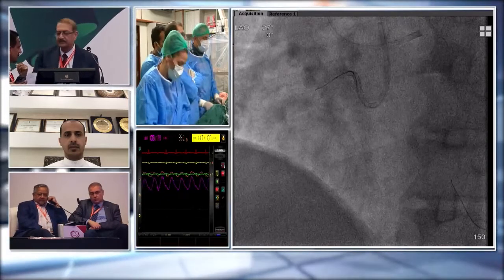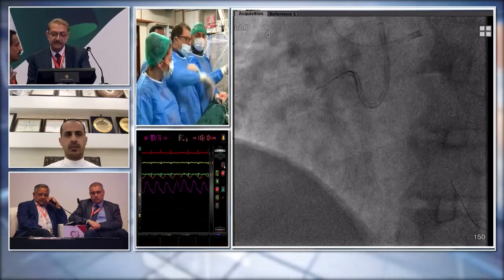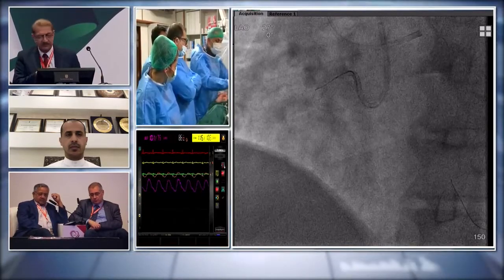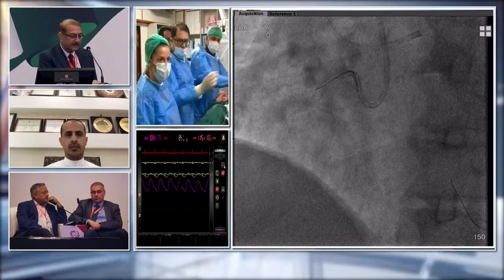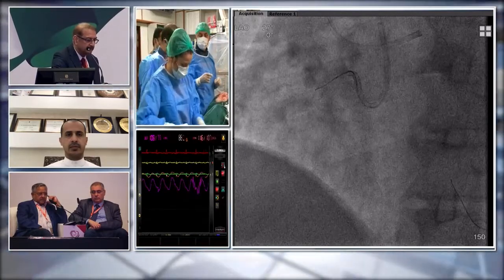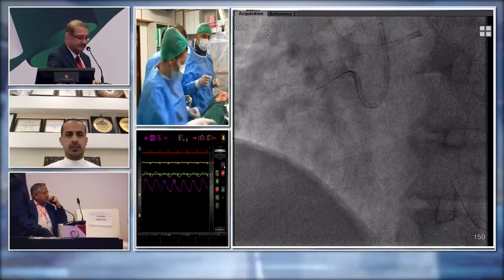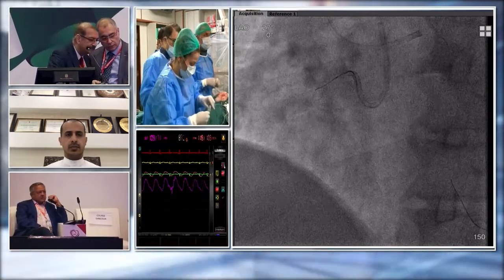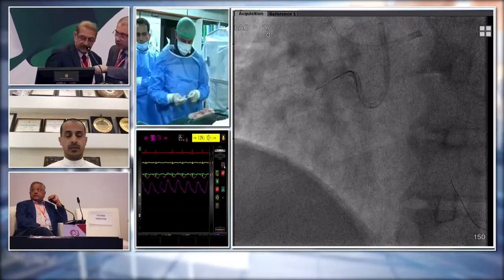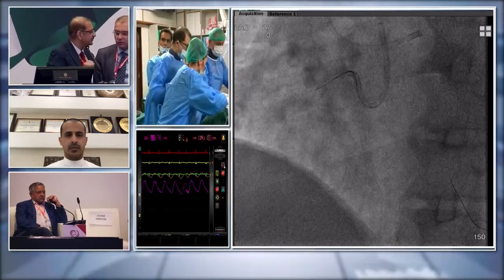Where is the, do you have the, yes, we did get it here. All right. Okay, we have the IVUS on the table. Let's show you IVUS first, okay? Can I have the IVUS, please? Let's measure the lumen. We have a stent. Also, we can check the stent at the LAD.